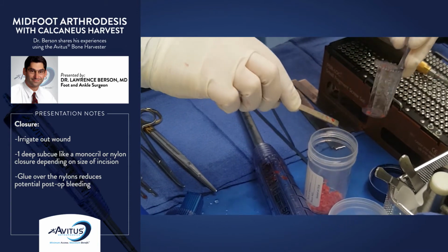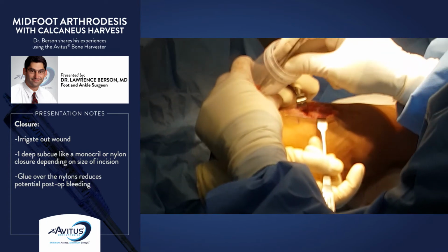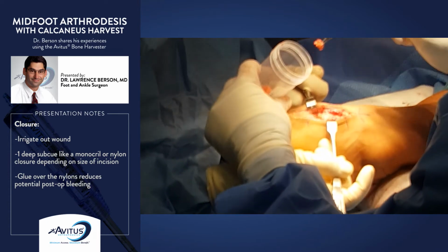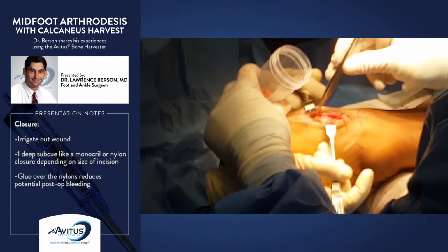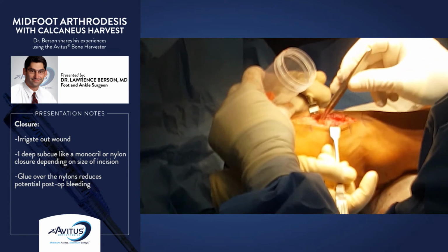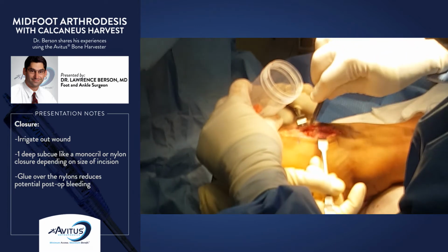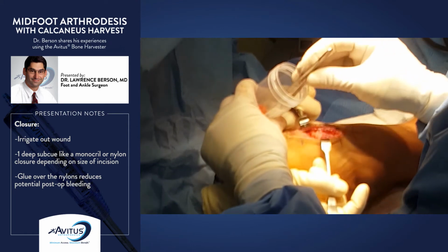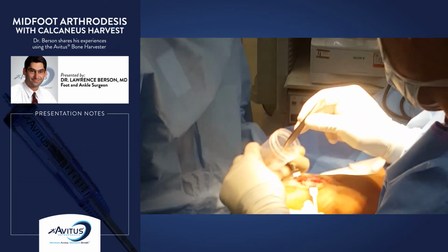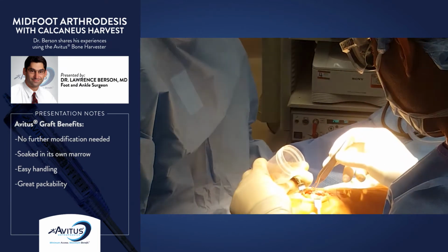Depending on the size of the wound, I may put one deep subcutaneous stitch, like a Monocryl, or if it's small, like 10 millimeters, I may just do a nylon closure. I've just been using some glue over the nylons, and that's been working well, cutting down any bleeding through the dressings.